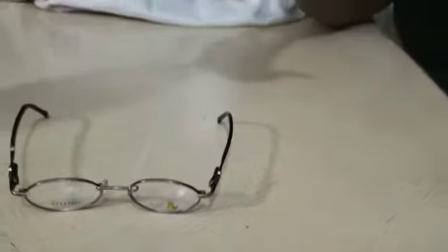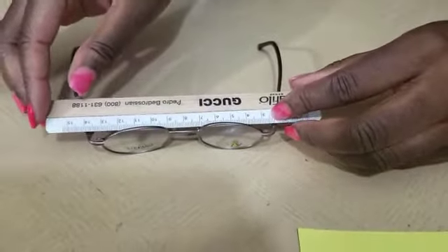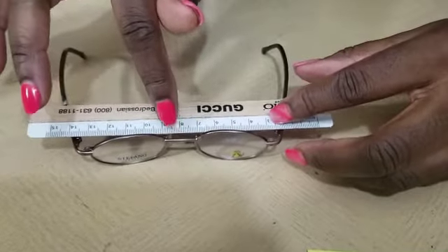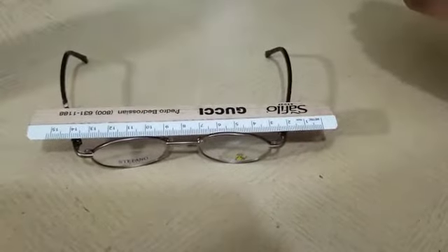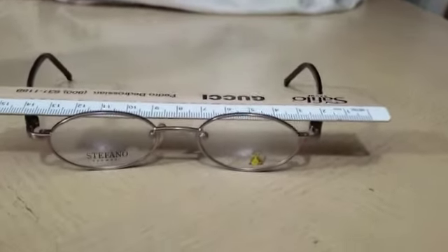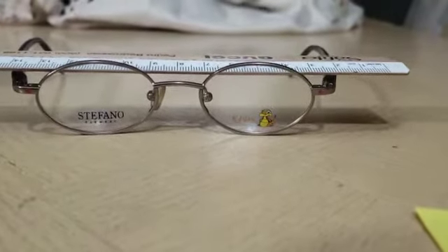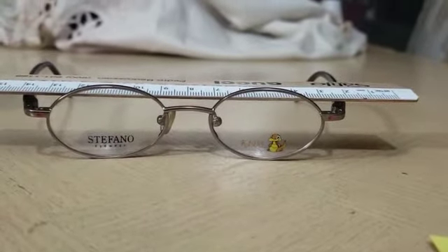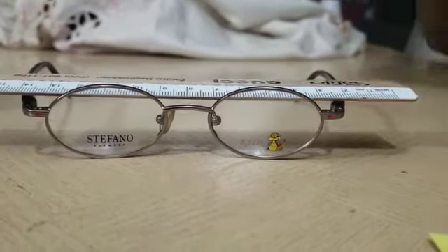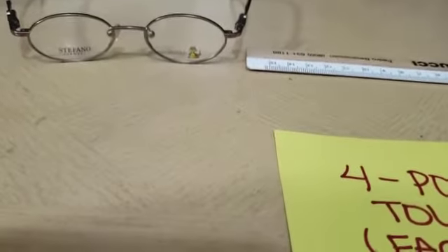I would take the PD ruler and place it on the back, and when it only touches the bridge, that means I have a negative face form. So in order to fix this, I would have to use my hands and bend inward to increase the face form, then use the ruler to make sure that it touches in all four points.